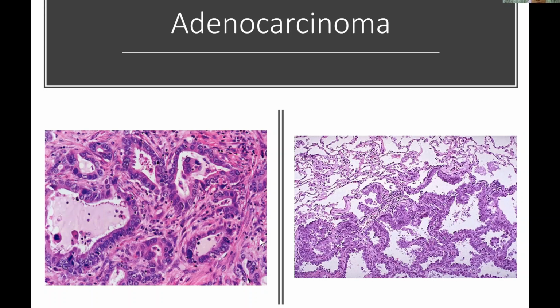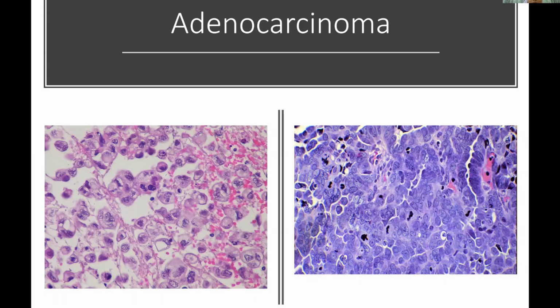When we get a case like this, where the specimen is labeled as lung tissue, and we see lung tissue adjacent to a tumor forming glandular structures like this, we can straightforwardly say it's adenocarcinoma without any staining, because it's a very straightforward case. How about another case? It's also labeled as lung tissue, but what we saw in the histology.